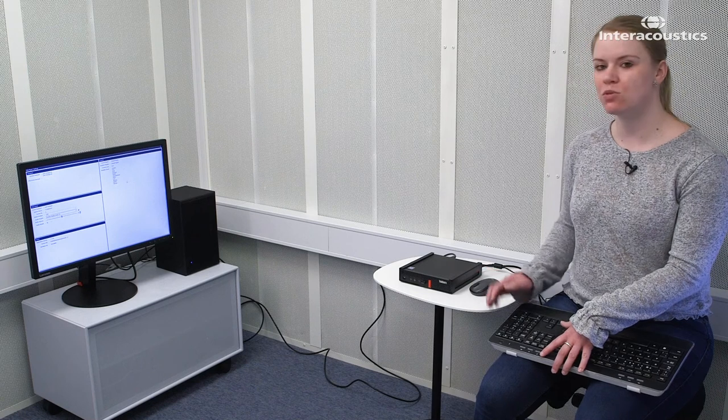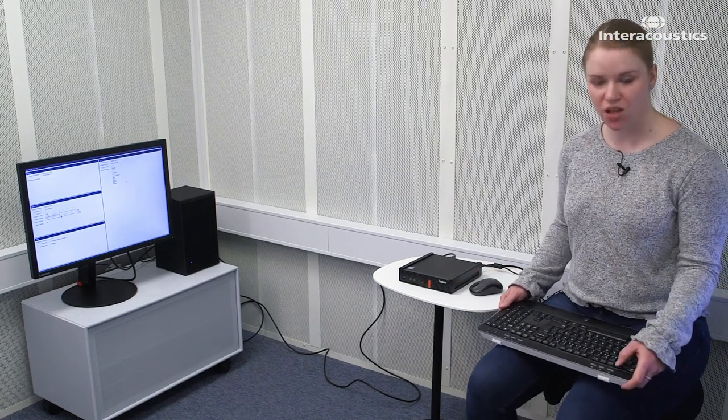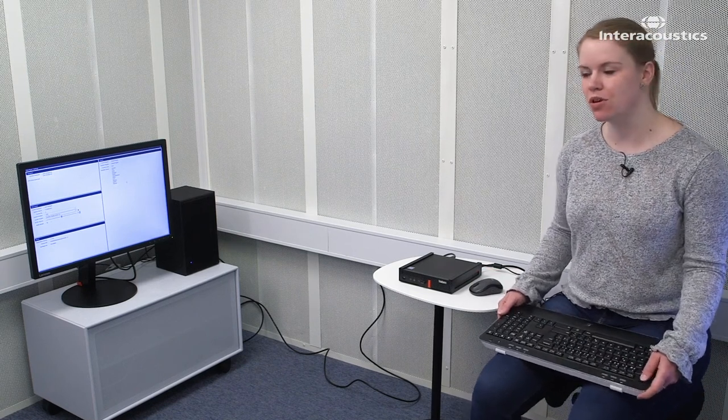When you're done with your settings, you just press F1 or escape on your keyboard, and then the settings are saved and you are ready to go. Thank you.